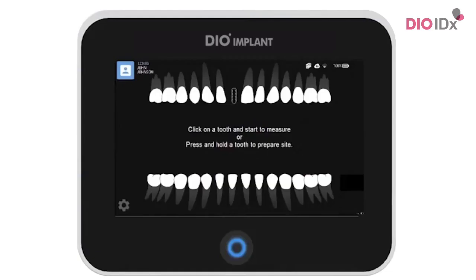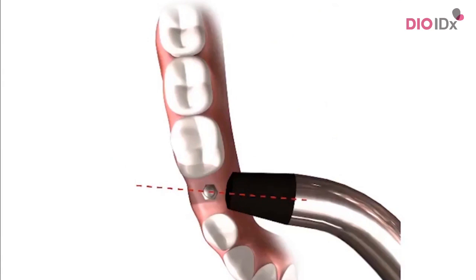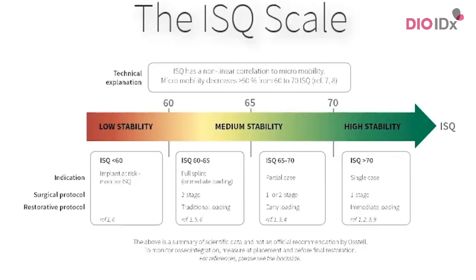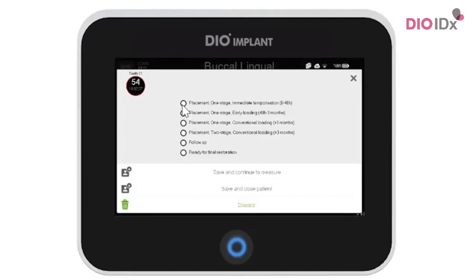You can now measure. Simply click on the tooth and measure from two different angles. That would be buccolingual and mesiodistal. The ISQ values will appear on the screen. They are color-coded according to the ISQ scale. Click on Save. Choose the applicable situation for your measurement session. This information will be useful for you later when checking on your ongoing implant treatments in Osstel Connect. You can now either finish or continue measuring.